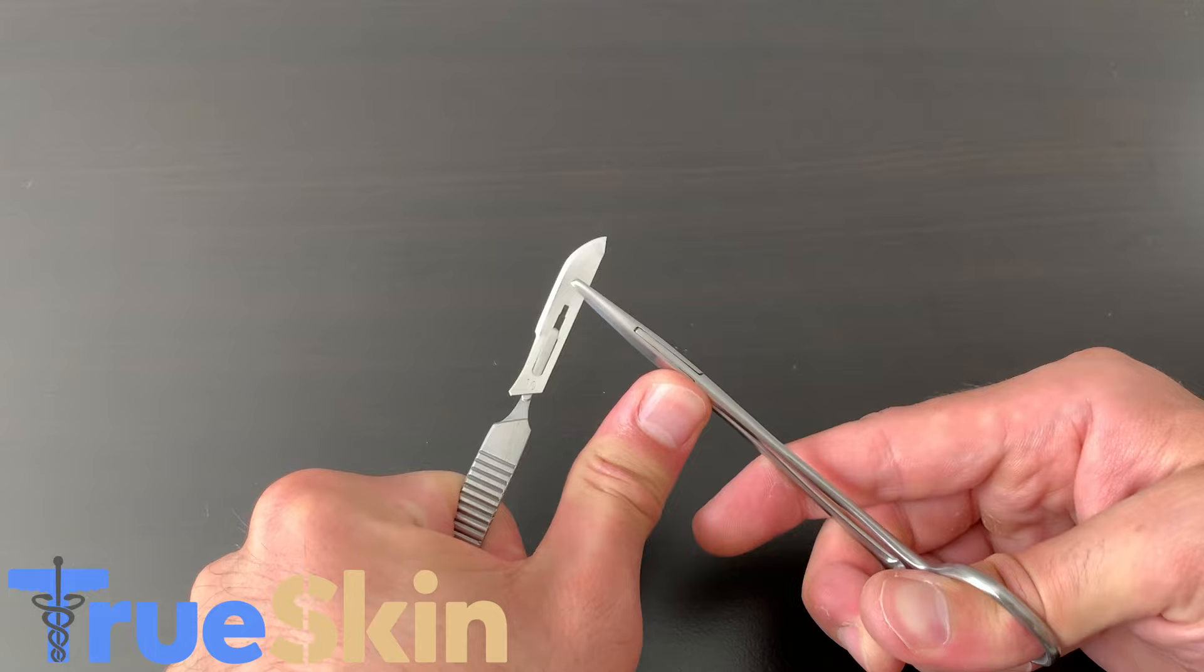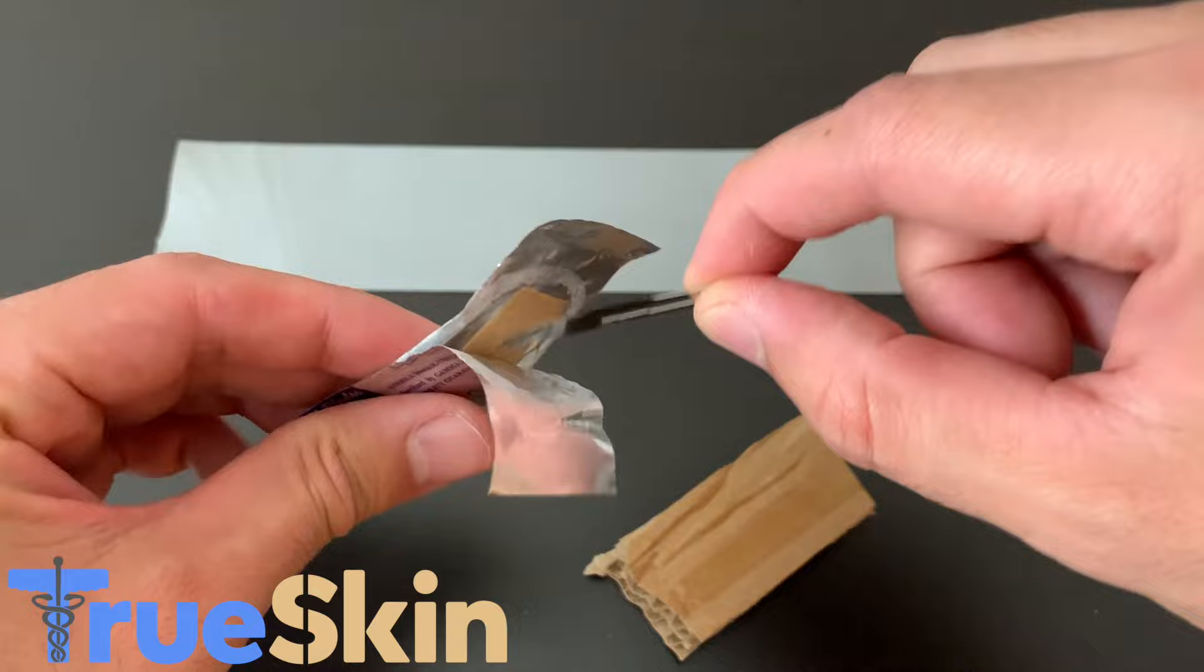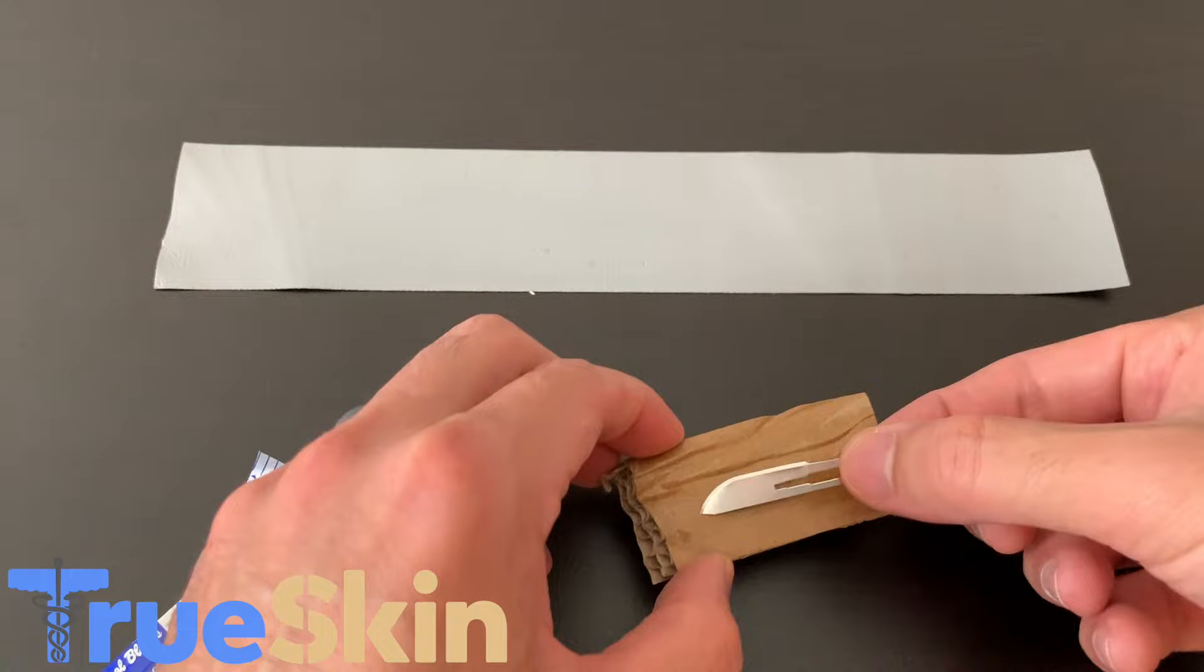Now we never want to throw a blade in the trash can. To secure it, go ahead and place it back in its original package. You can tape it up to secure it that way, or if you've lost the package, you can use a piece of cardboard and tape it up to secure it.